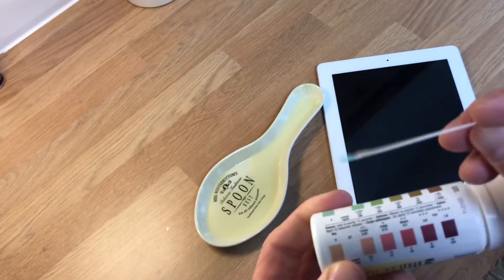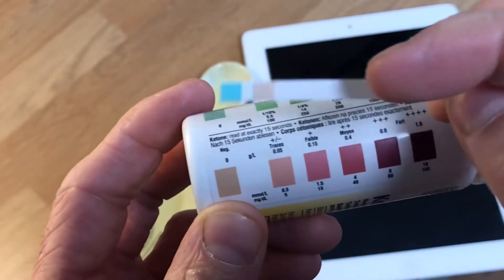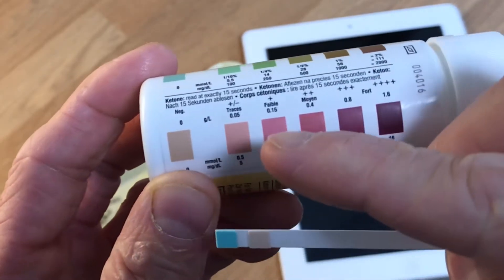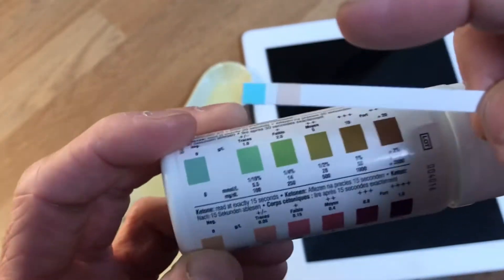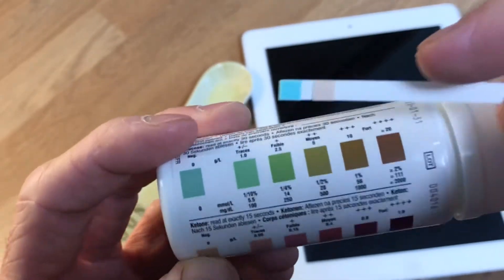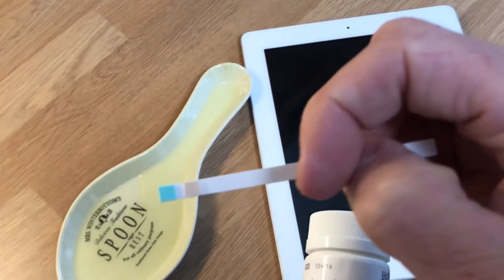Quite simple — there's a chart on the back of the tube. Your pink strip here: after 15 seconds you check your ketones, and after 30 seconds you check this one along here. Quite simple.